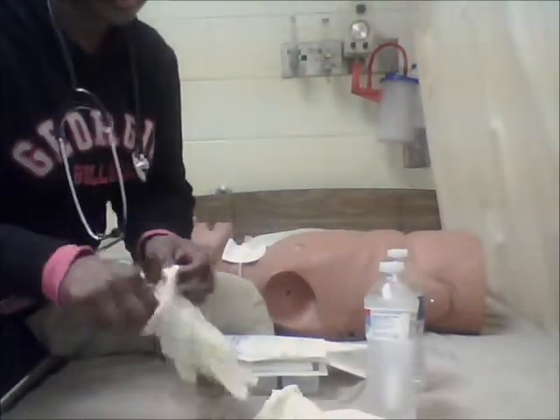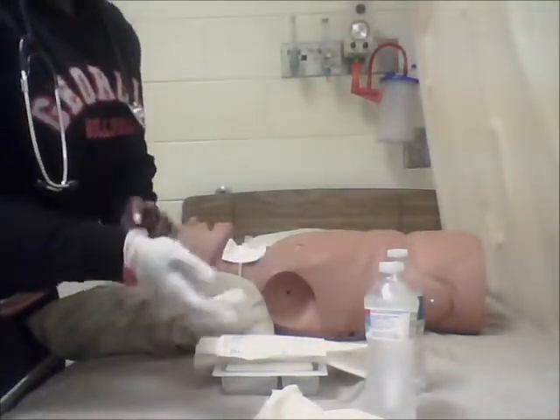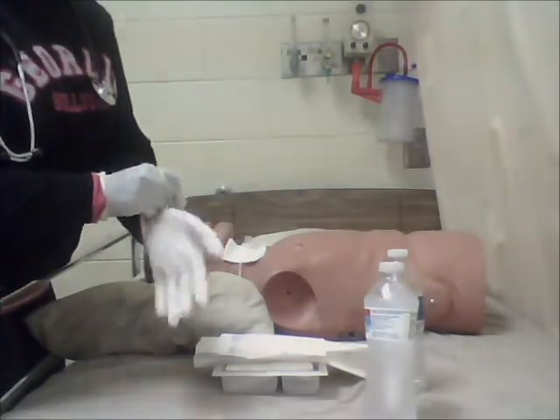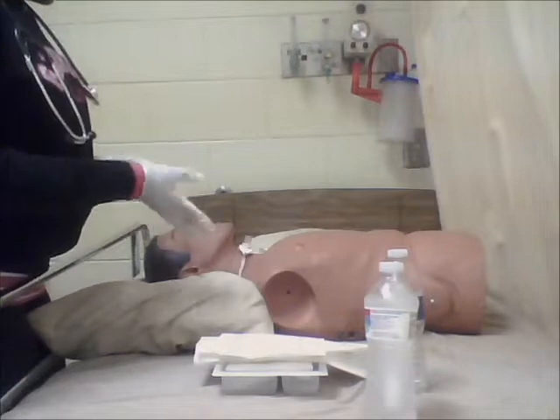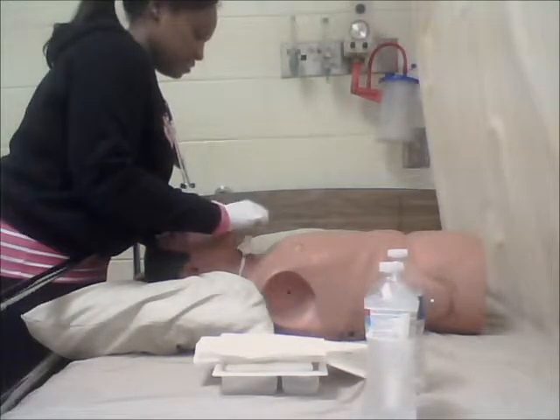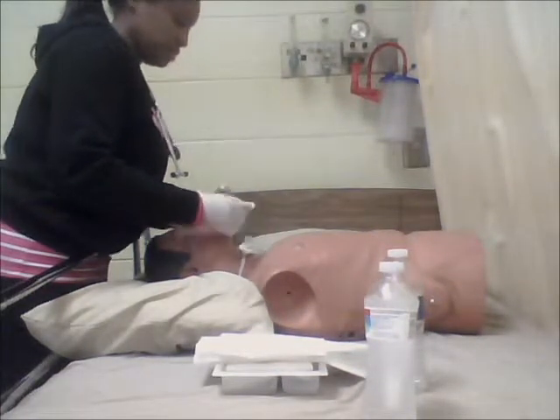So first, I'm going to put on my gloves. Well, wash my hands first, then put on my gloves. Then I'm going to remove the old gauze and discard. Then I'm going to go ahead and suction the patient. Make sure that I get any excess out of the inner cannula.